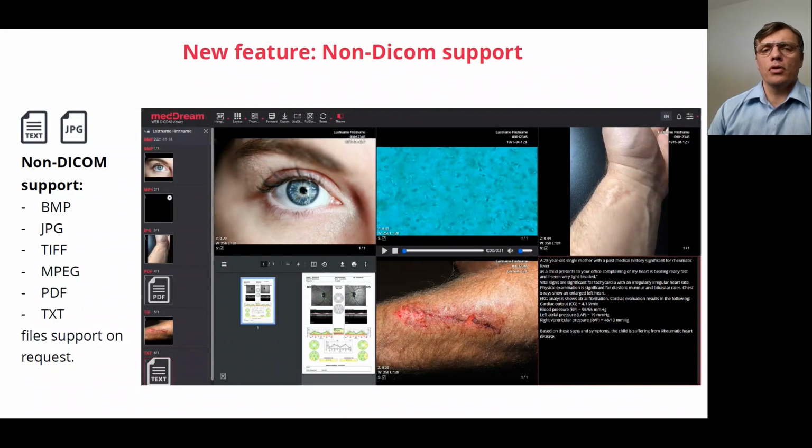So now I'm switching back to my presentation, and again, for all of our partners, please, you need to know that only your imagination limits the functionality that you can achieve with our systems. So I really recommend that you brainstorm about the user experience you would like to get in your systems using our technology, because, as I said, our integration team can help and assist in every way. You just need to utilize the knowledge and experience.